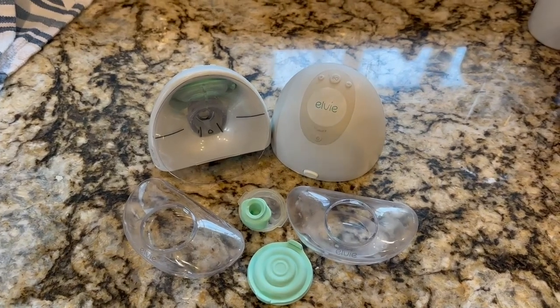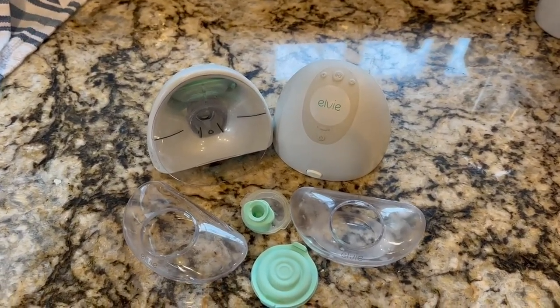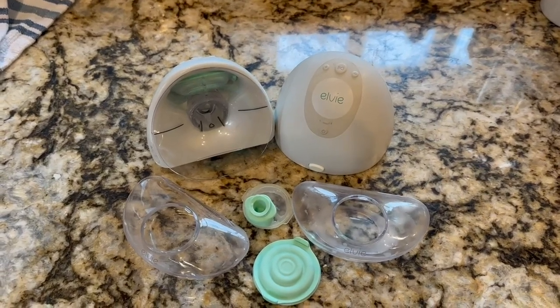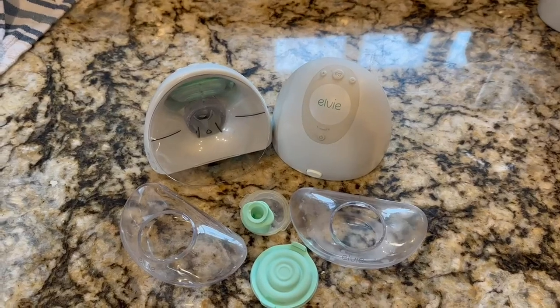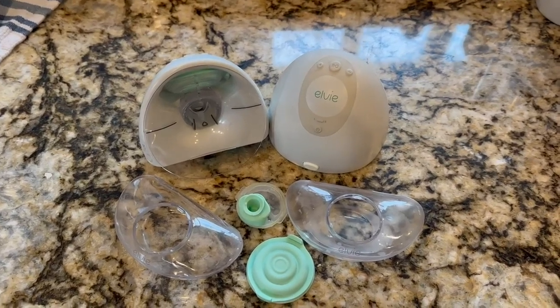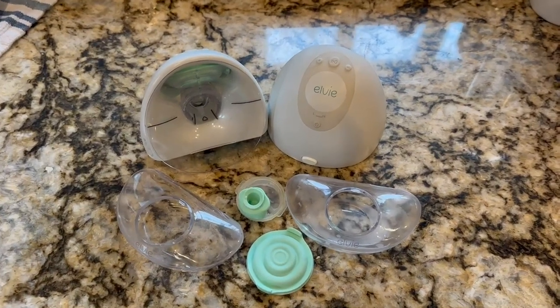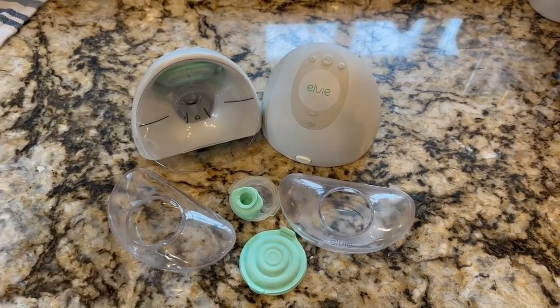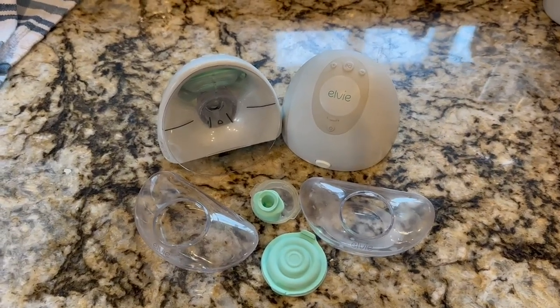Otherwise, the ease of using the breast pump is fabulous. There's even an app you can use to set it up so you don't even have to touch it while wearing it. I would recommend this breast pump for sure — just be prepared to rebuy a few things, and washing is a little bit of a challenge. But the fact that you can just wear this breast pump hands-free is a huge, awesome thing, especially as a busy mom.